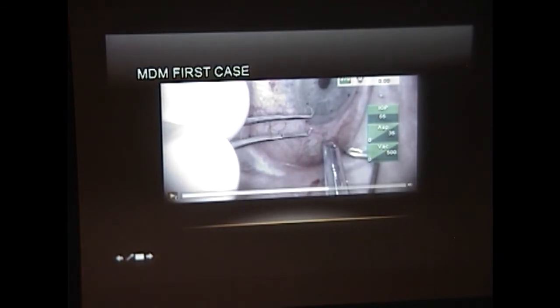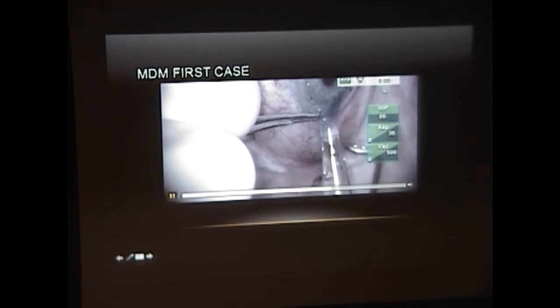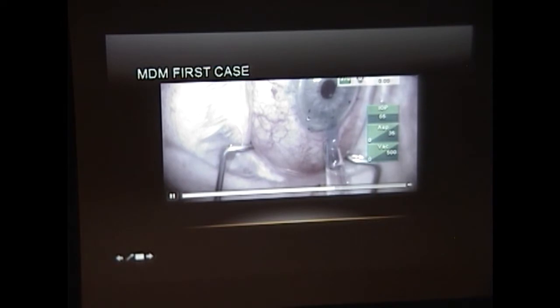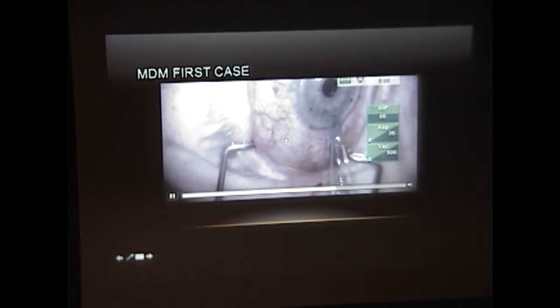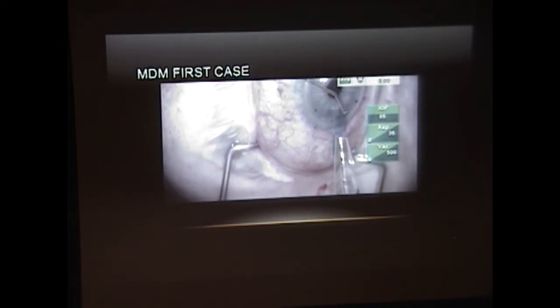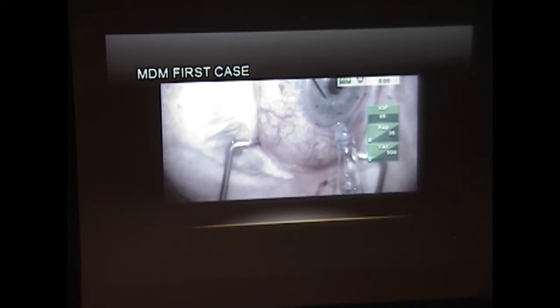And I'm going to stop the video right there. You can see the graft is right at the edge of the injector. But we're going to go and bevel up. But because the graft is right at the edge, this is another learning point. Unfortunately, as soon as it touches, it just comes right out. And so now we're half in, half out. And we need to try to get the graft back in a little BSS and take it back out of the eye. And now the endothelium is really mad at us.